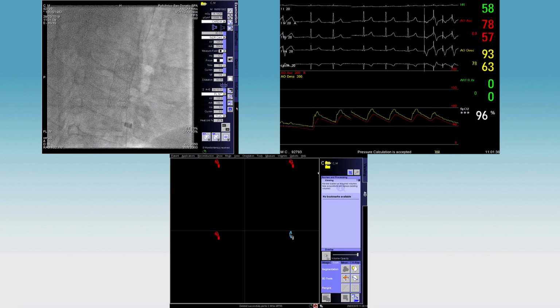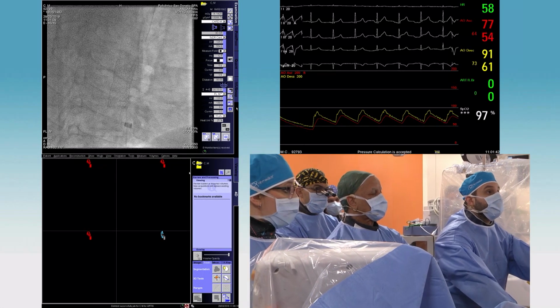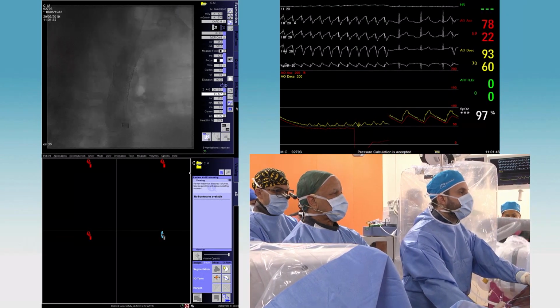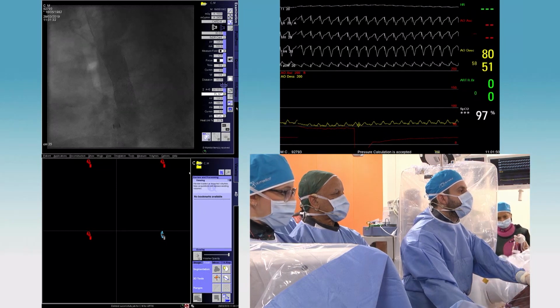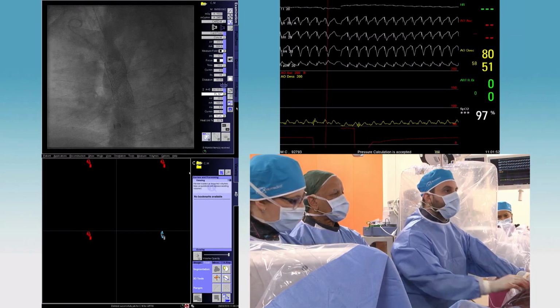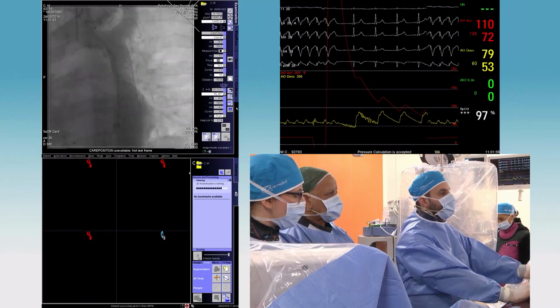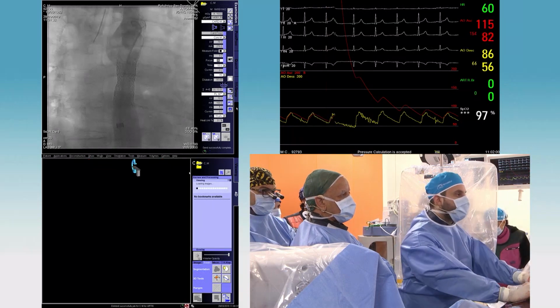We go, and we're doing pacing. Okay. Hold the breath. Go with the injection. Have you ever tried injecting not into the aorta but into the ventricle? It allows the contrast to mix a little bit and then you have the aorta full, and you can see everything even without pacing. Usually we use undiluted contrast.